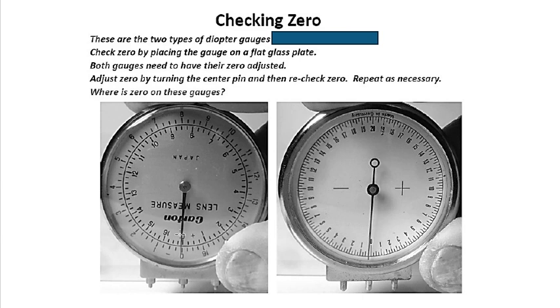And don't worry about this, because when they take the picture of this, if somebody is holding it here, because of the angle you can see it's not on the zero, but actually it is on the zero. It's just that the camera is taking the picture from this side. That's why the camera lens is supposed to be at 90 degrees to it, so that you can see the hand directly on this zero.